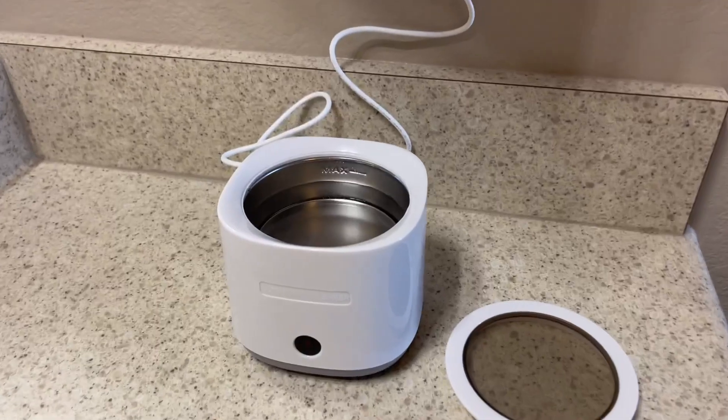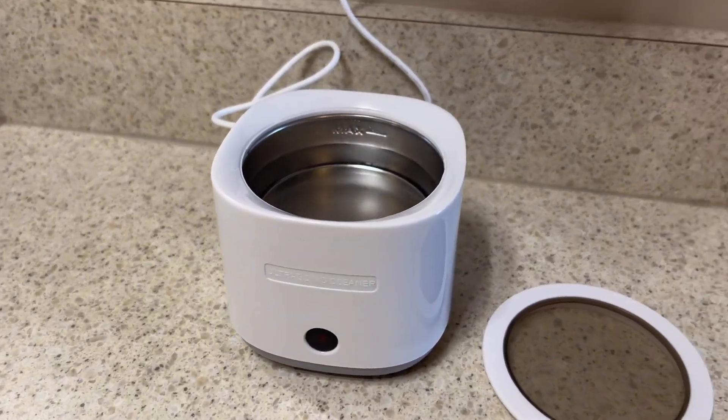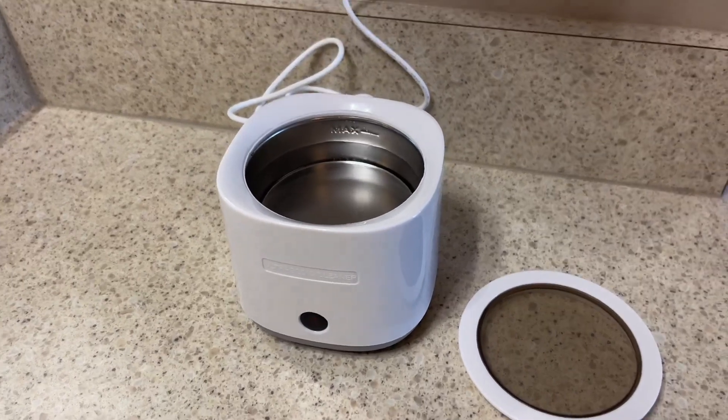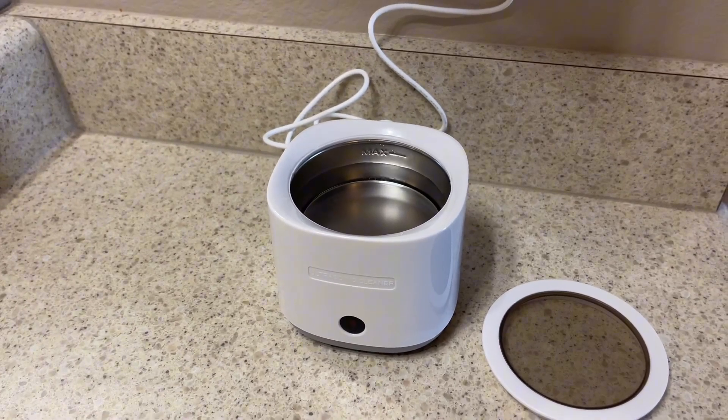Here I've added water. As you can see, there is a max line. It says do not pass the max line. I just went right under it, and I'll go ahead and show you how I use this.